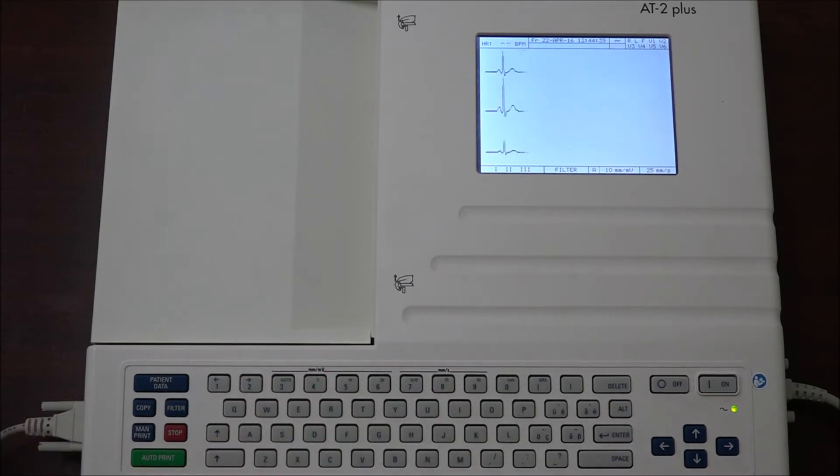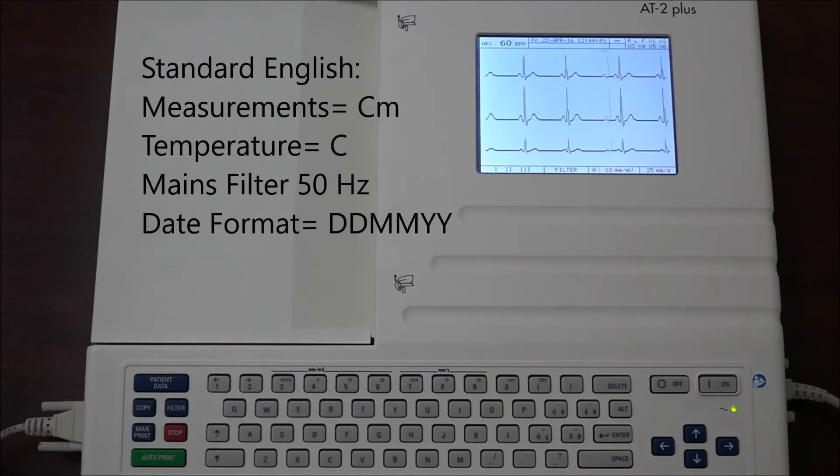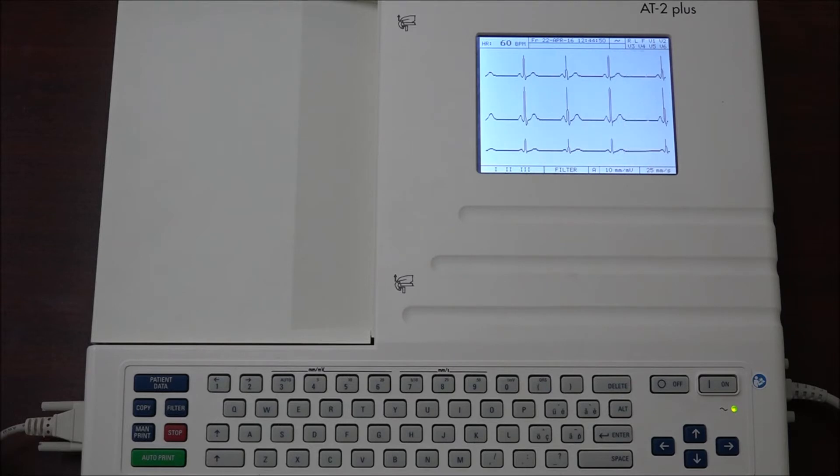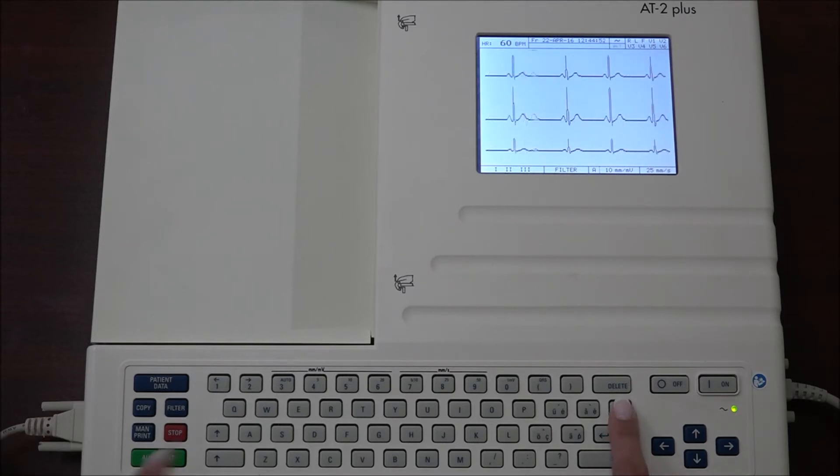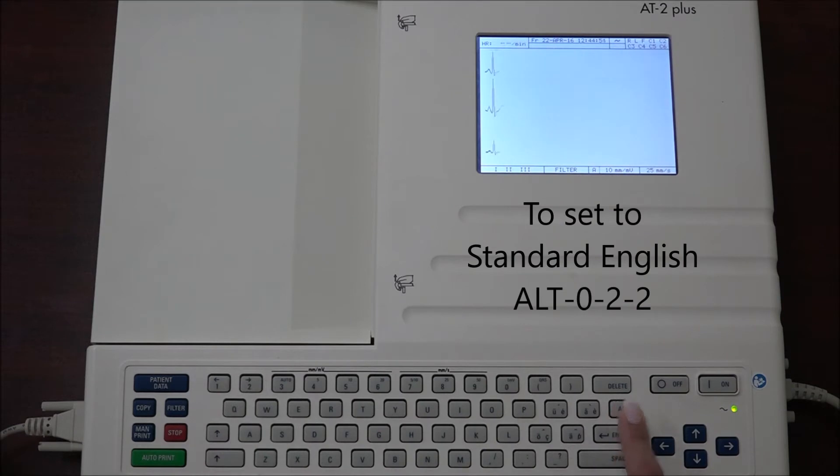Standard English measurements are in centimeters, temperatures in degrees centigrade, and the mains filter set to 50 Hertz. The date order is day, month, and year. To select Standard English, press ALT 0 2 2 stop.